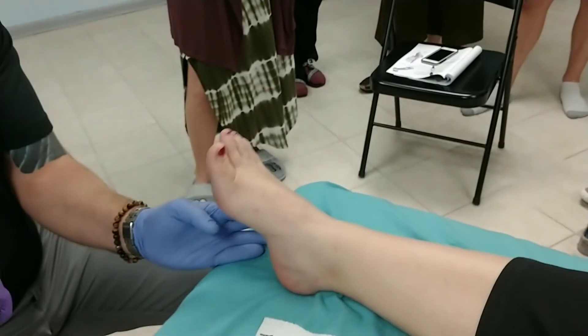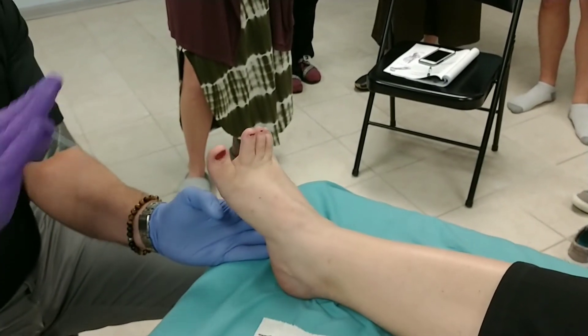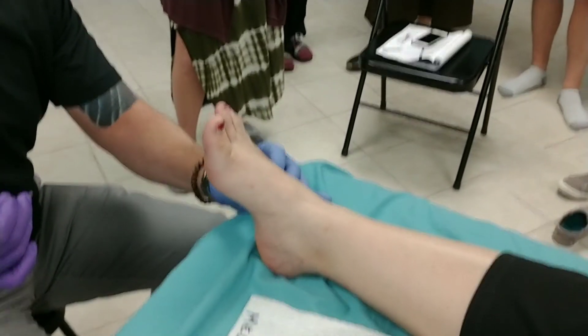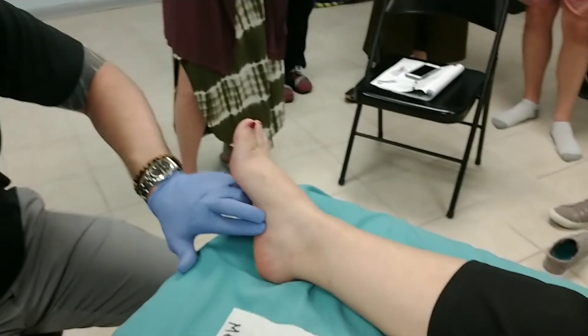You can palpate the muscle from underneath here. It's hard to control your toes like that. If she splays out her toes, you can feel it tense up under there. I just kind of grab off the edge of the fifth metatarsal and you can kind of pincer that and just needle into what you're pinching.